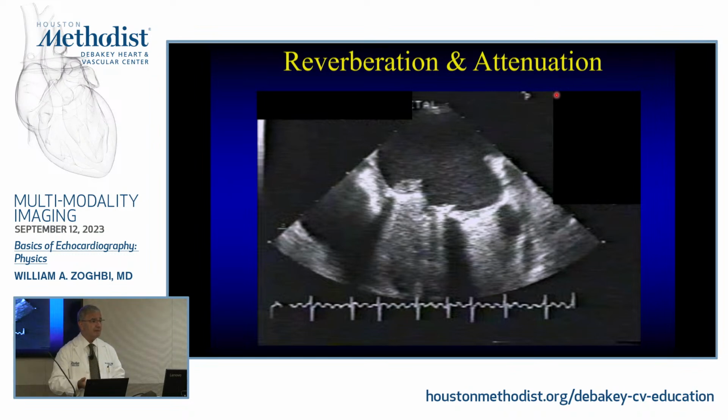And that's why when you have people with mitral annular calcification, when you go to the lab this afternoon, take a look and you'll see a black shadow behind it, right? And then it moves following what this piece of calcium is doing. So then you know it is highly reflectant.